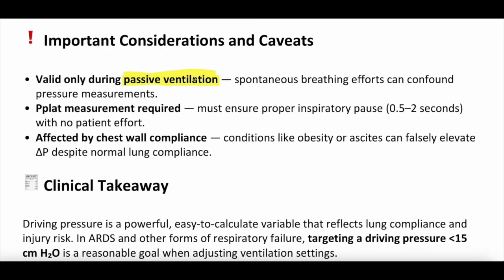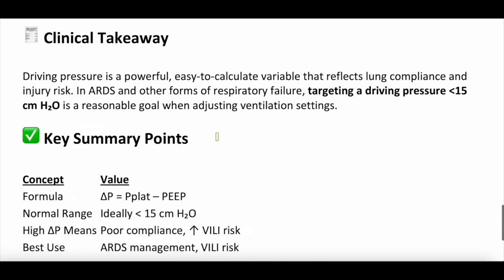If the patient is breathing a lot on their own, they're dyssynchronous, what have you, you can't really do this. It confounds the measurements. You need a plateau pressure to do this. So you have to measure the plateau pressure appropriately or your driving pressure will be off. And just remember, this is affected by chest wall compliance. Although the driving pressure takes some of that out of the equation, it still does take it into account a little bit. So clinical takeaways here and then key summary points.